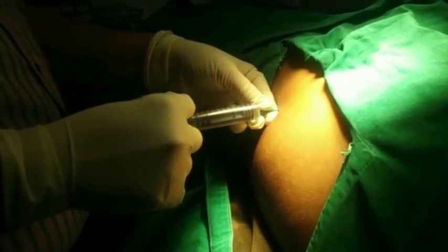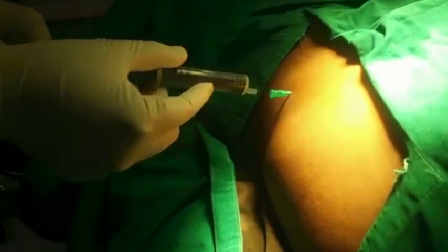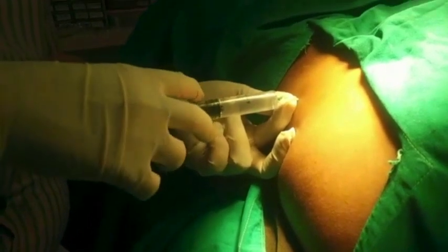You can see I have injected 10 ml, and after injecting 10 ml of the drug, I can see the backflow of the drug. If you are in the fascial plane, then only you will get the backflow. If you are in the muscle, then you won't find such backflow of the drug. So I am injecting a total of 20 ml of LA.